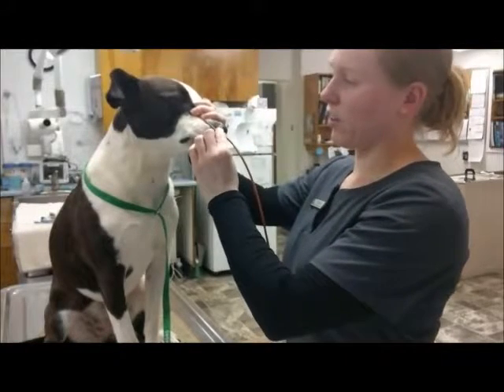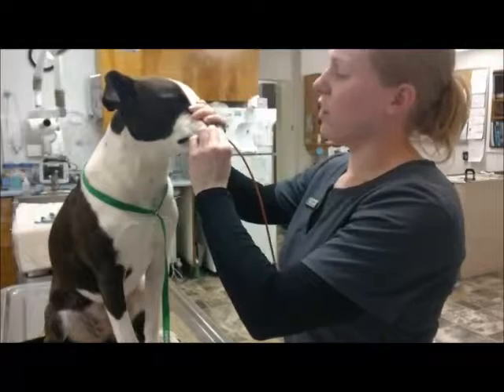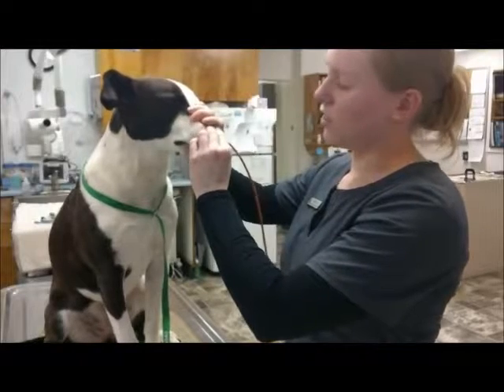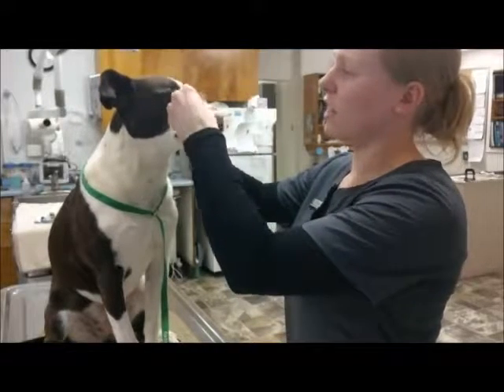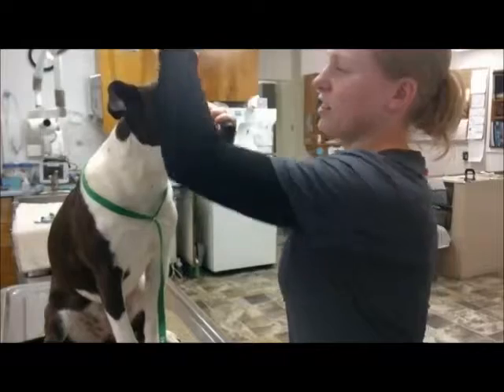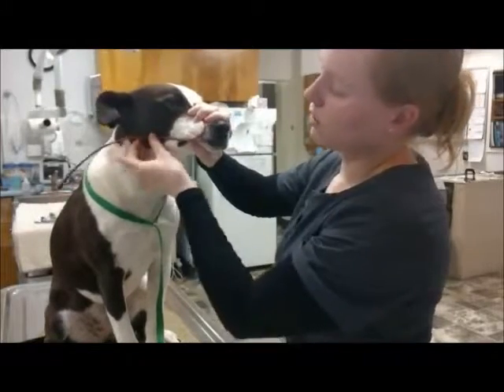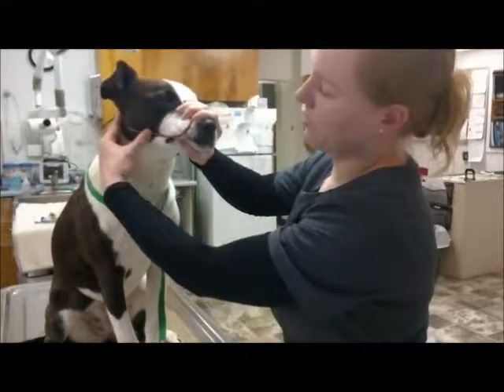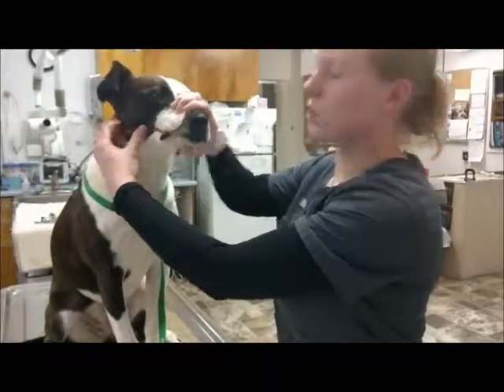That marked length is the portion that goes inside the nose. Once inserted, you flip it back around and either staple it and tack it into the middle of the face, or run it down the side of the face, then hook it up to an oxygen source.